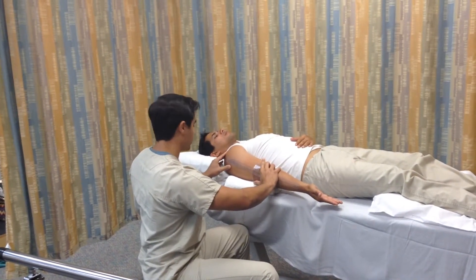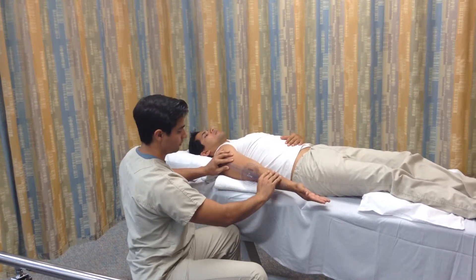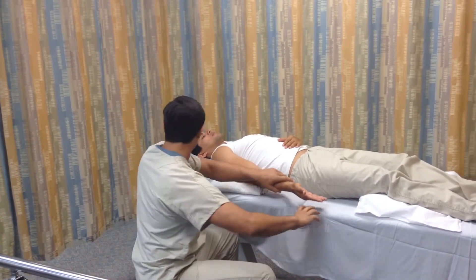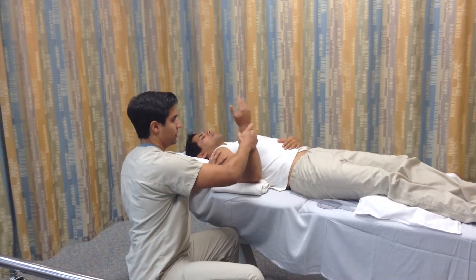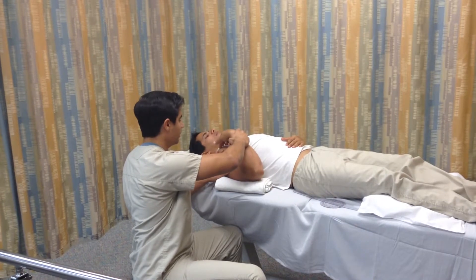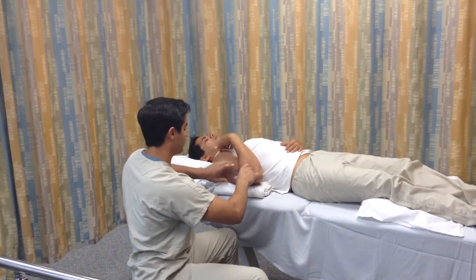We'll read and record the starting position, which is close to zero — a couple of degrees. We'll then move the goniometer and perform passive range of motion, keeping the forearm supinated. We'll replace the goniometer with the fulcrum at the same landmark.